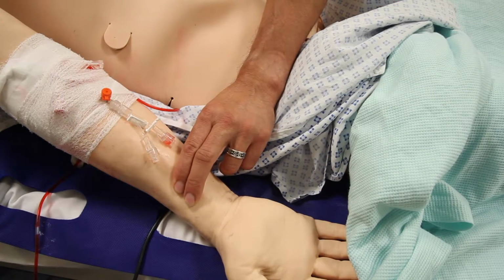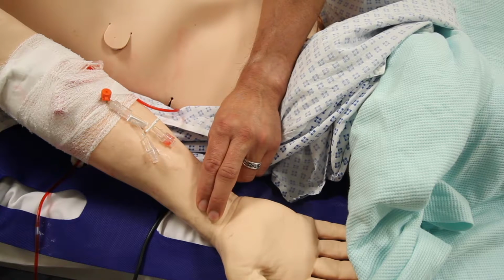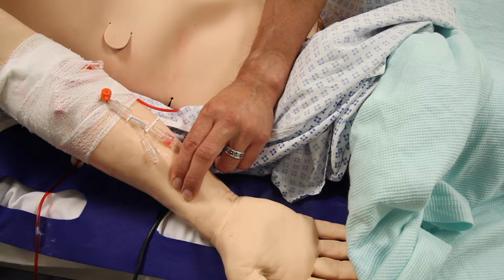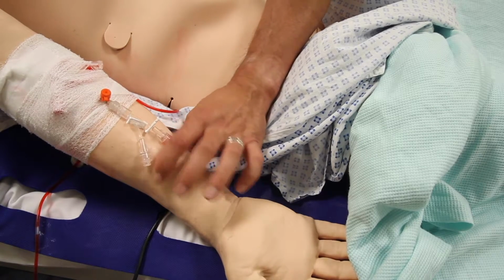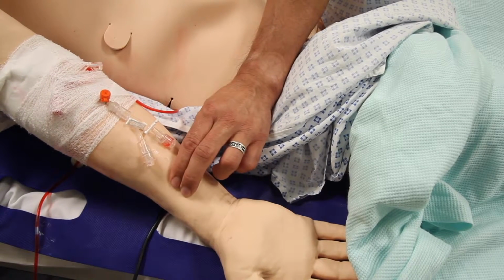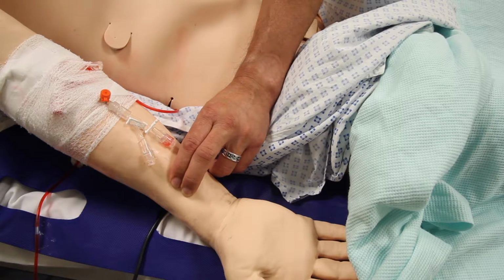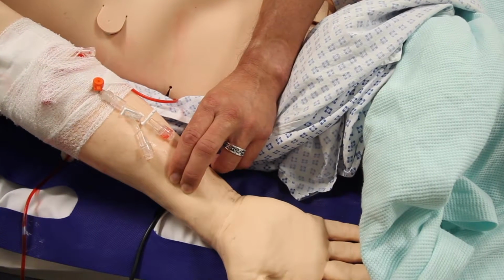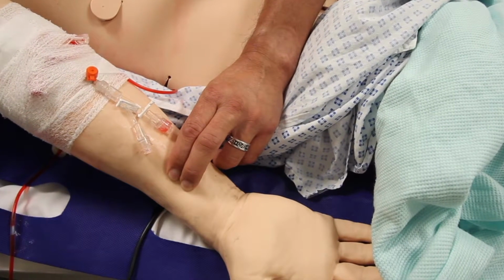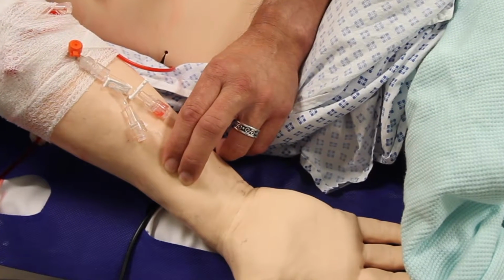So from a radial pulse point of view, on real people you would normally feel a little bit lower here, but his pulse point is just a little bit higher here. And really the way of detecting any of these pulse points is to kind of feel a bit around the hard plastic, and when you can put your fingers in a little divot, that will be where the pulse will be. So the idea is you press on it and just to keep a gentle pressure, that keeps the mannequin talking with the pulse and making sure it keeps generating that pulse. If you press too hard, you'll totally occlude it and you won't feel anything.